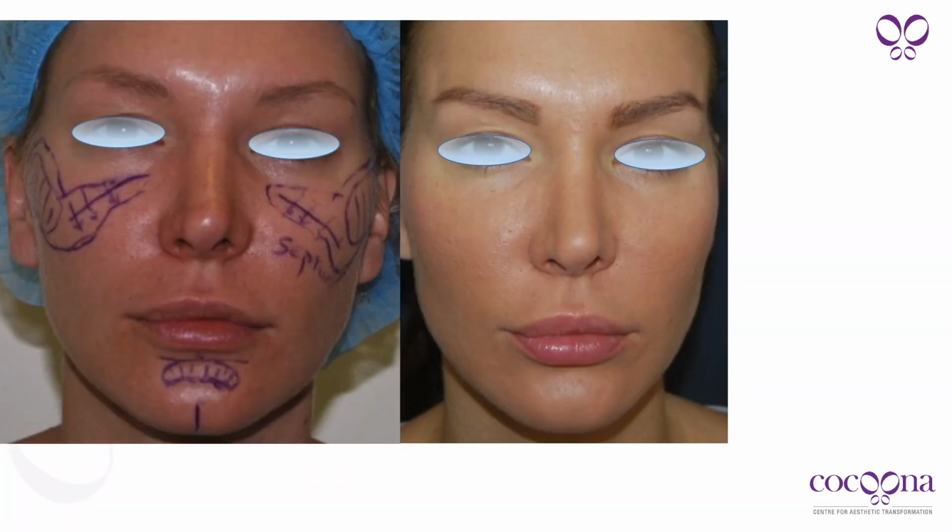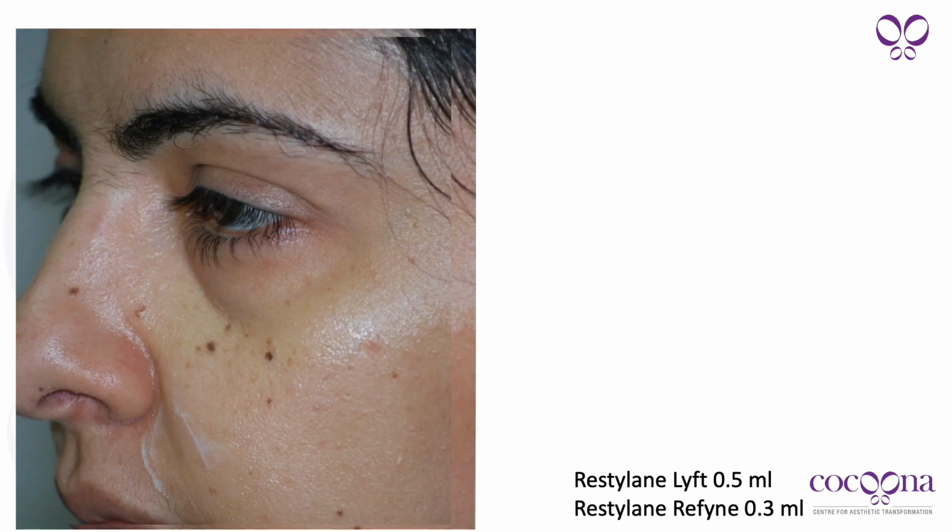So that's an example of filler injection using a cannula technique in a surgical way to dissect the retaining ligament and inject the fillers.